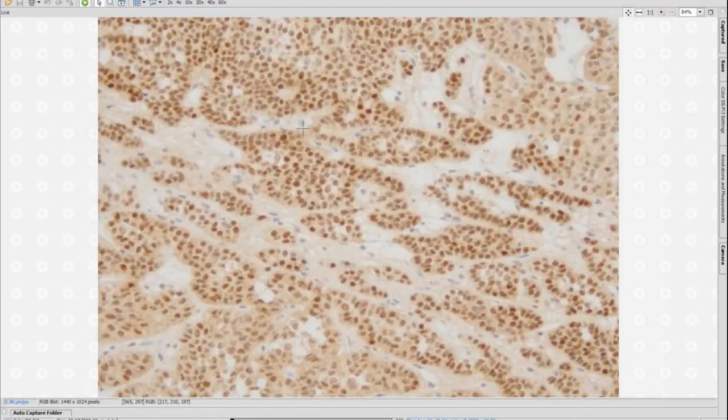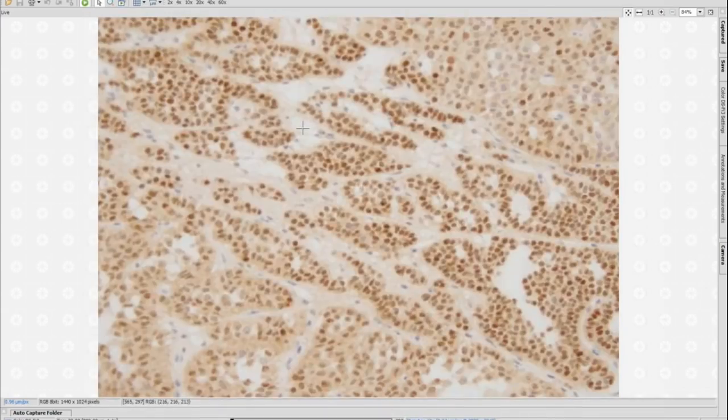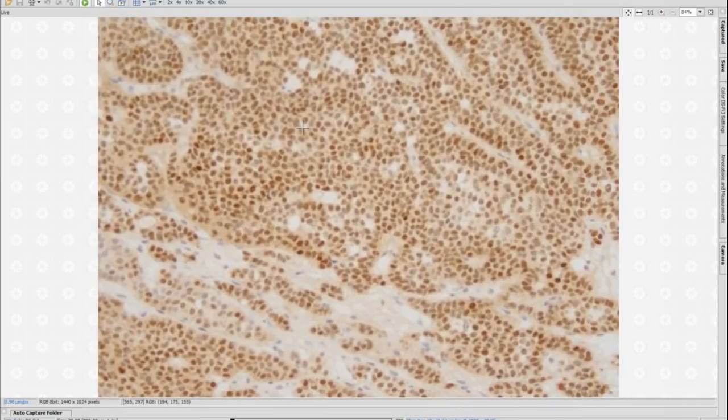It's a transcription factor, as you see. You see it as a nuclear stain, and it's one of the markers of these gonadotrophic adenomas. It's not one of the adenomas that you need to recognize all the time. It doesn't have that much clinical significance, but you have a very nice marker here that is helpful, even more than the hormones, really, to identify. So if you have this antibody in your lab, it allows you to specifically identify these subtypes.